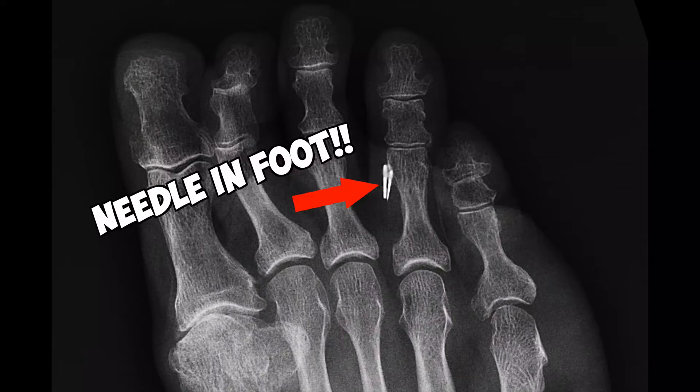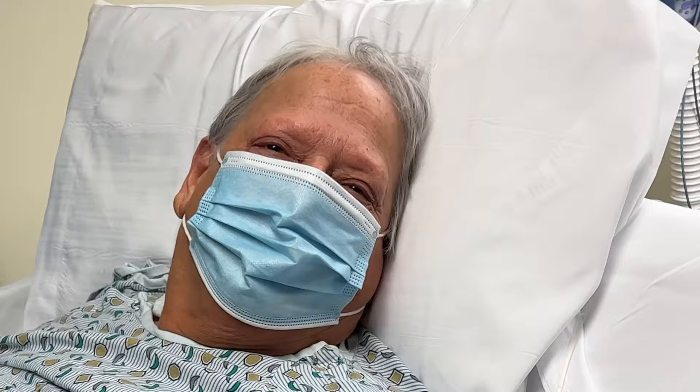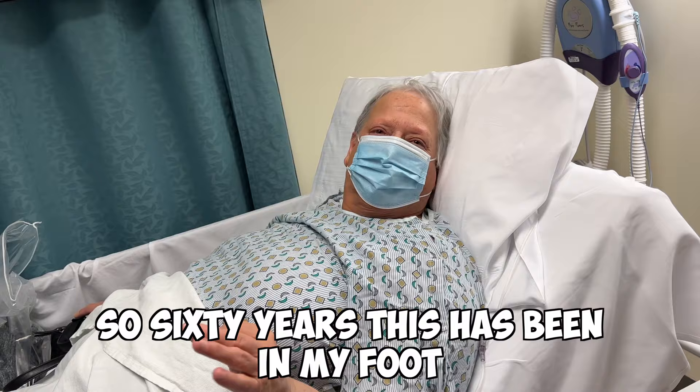We are going after a needle that's been in this patient's foot for 60 years. We got it! Tell us what we're taking out - a sewing needle that I stepped on when I was six years old. How old are you now? 66. So 60 years this has been in my foot.